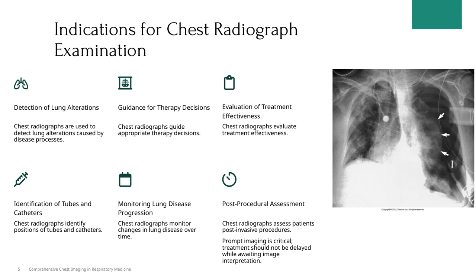Let's talk about comprehensive chest imaging in respiratory medicine, focusing on slide 5. First, chest radiographs are essential for assessing patients after invasive procedures. They help us quickly evaluate what's happening in the lungs without delay, so treatment decisions aren't held up while waiting for detailed image interpretations. Next, these radiographs are invaluable for monitoring changes in lung disease over time. By comparing images taken at different points, we can track disease progression or response to therapy.